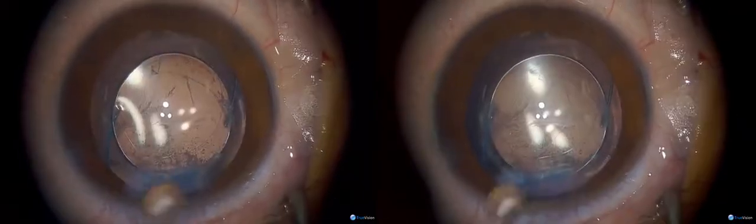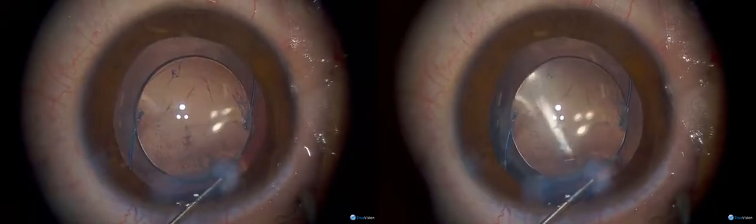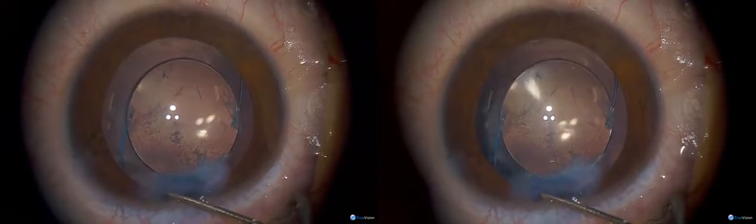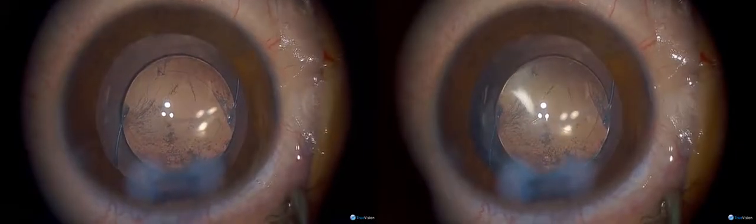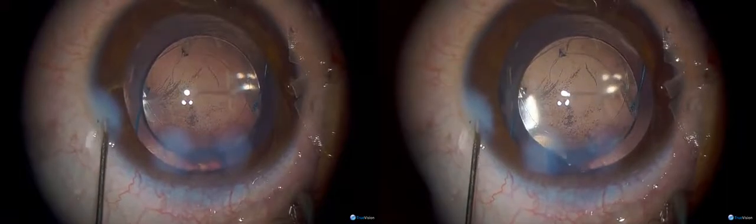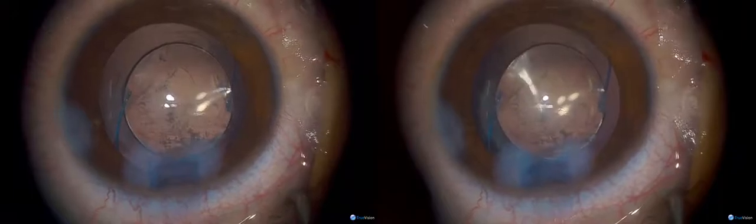If he wants to read with both eyes he'll have to have a plus lens in front of the left eye. Why don't you use triamcinolone to make sure there's no vitreous in the anterior chamber? Because at this age the vitreous is very thick and it doesn't tend to come into the anterior chamber — it's very formed and solid like a jelly.